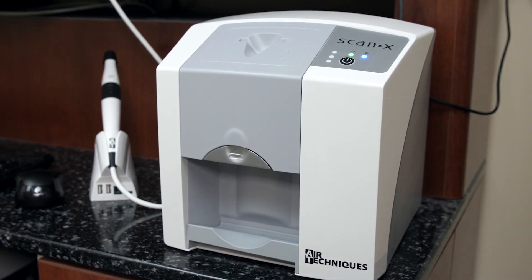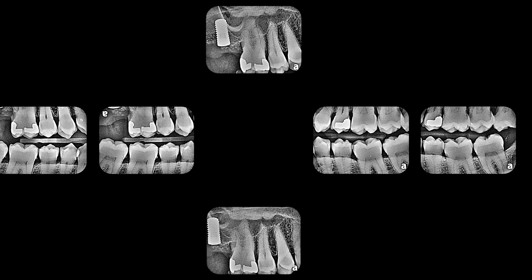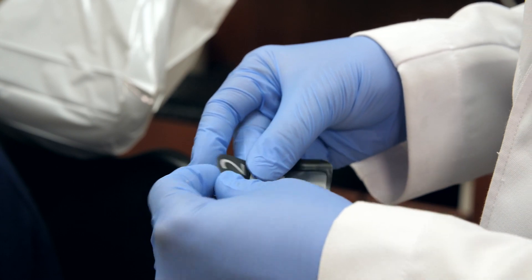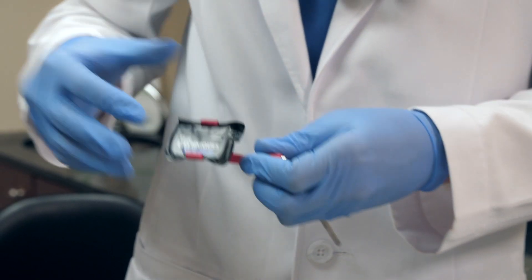One of the most important features of ScanX is image quality. It provides a sharp, diagnostic image that allows me to treat my patients most effectively. The phosphor plates are thin and flexible, so they're easily handled by our staff and well tolerated by both our children and adult patients.